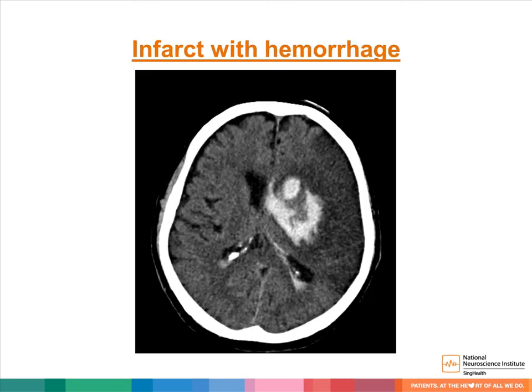An ischemic stroke can sometimes turn hemorrhagic. In this example, there is hemorrhagic conversion of the left MCA infarct.